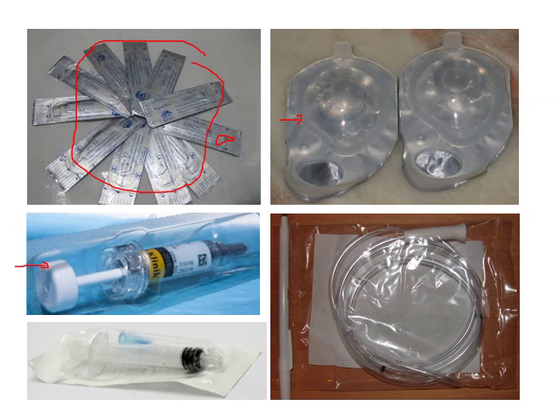This would be a hard plastic compartment tray type container. Again, it's very visible. You can see what's in there, easy to store. This would be a flow wrapped disposable syringe. It's sterile. And this is just pouch packaging of some tubing.